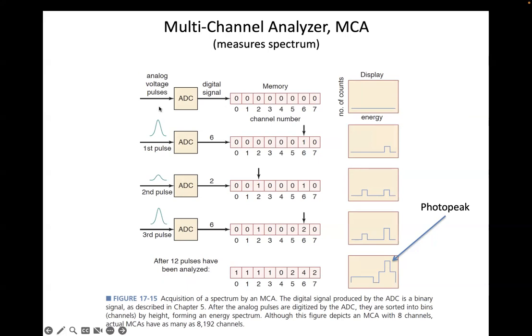Sorry, the analog to digital converter also knows which detector the signal is from. And so if the pulse height analyzer says, yep, it's in the right range, it'll put a tick at that box and record it as a signal. This is done over and over again, and you just fill up this 1D array, but you can imagine you have a 2D array for this, where you fill up a sort of intensity of detection here.